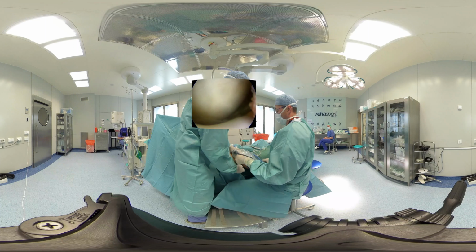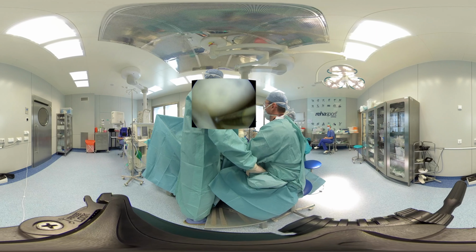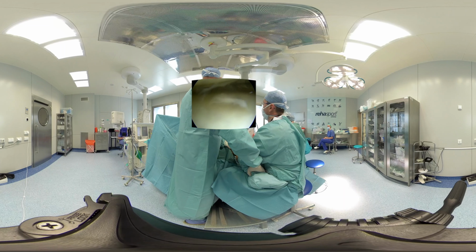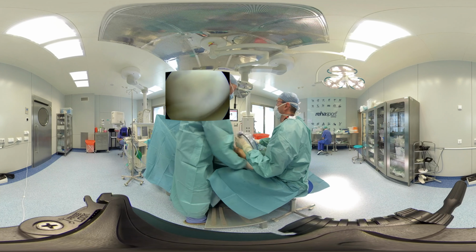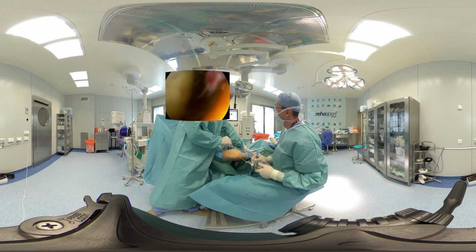We need to place the medial portal. Prop the medial access, medial compartment. Visible meniscus, medial, undamaged, stable. The femoral condyle cartilage and the tibia plateau also normal. Damaged ACL is visible in the anterior compartment.